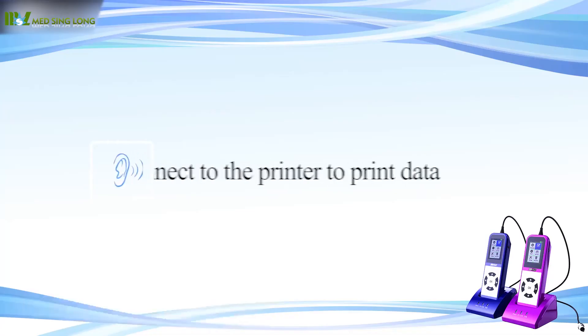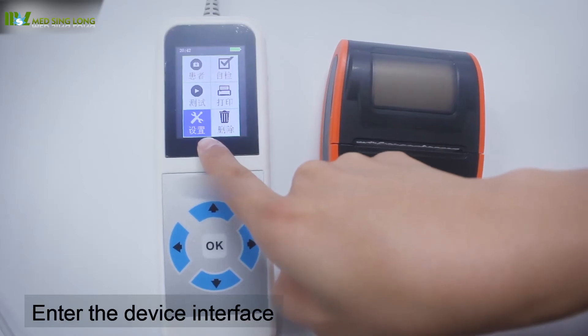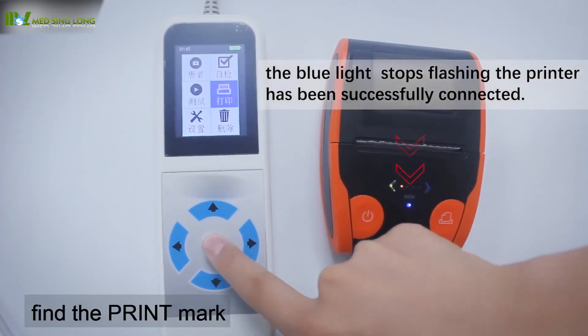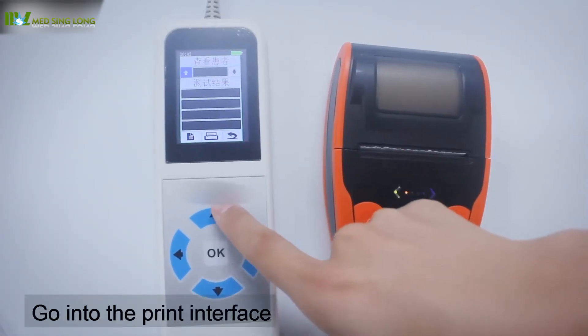Connect to the printer. Long press the power button of the thermal printer. The blue light will flicker. Enter the device interface of the main machine, find the print mark, and click OK to go into the print interface.